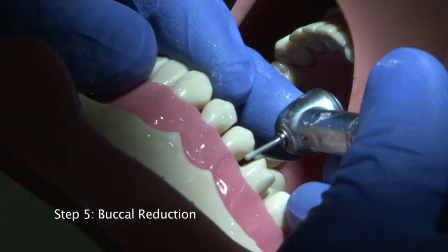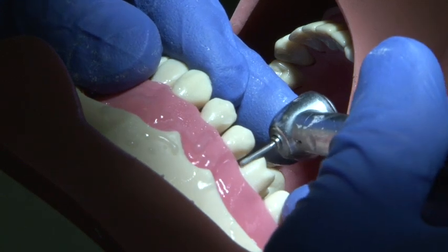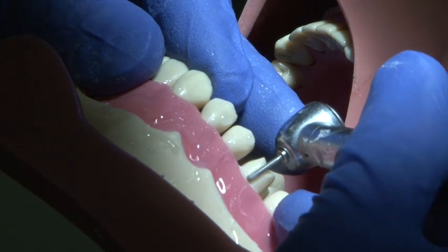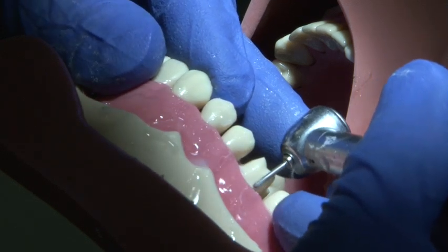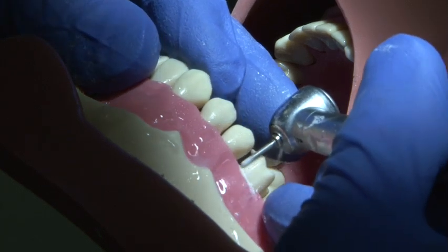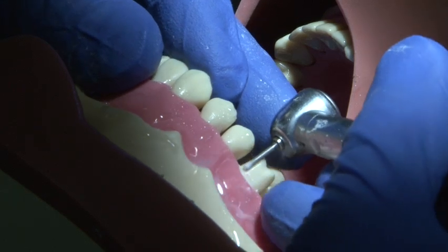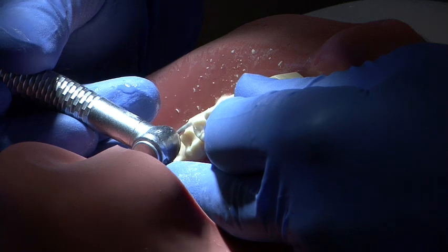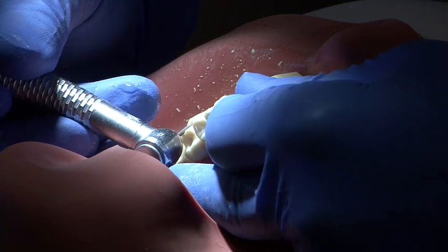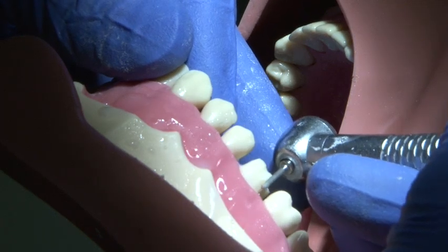Buccal reduction is carried out using a parallel sided round ended medium grit burr, with 0.7mm to 1mm reduction employed using a chamfer margin. A smooth continuous action will ensure that the preparation is as smooth as possible. A two-plane approach is used by altering the angle of the burr for the coronal section, which helps to follow the outline of the tooth.